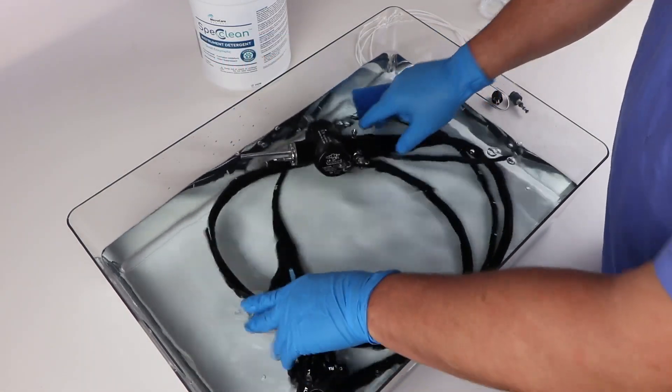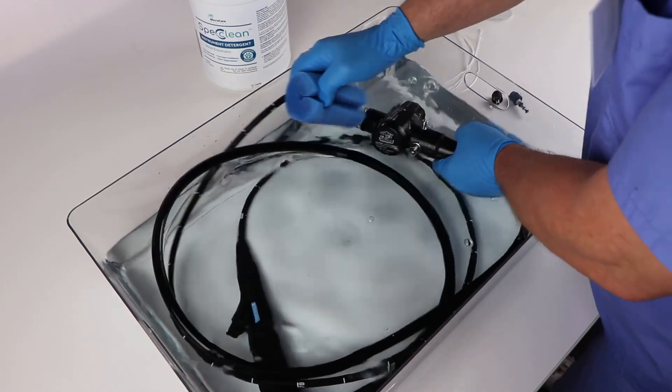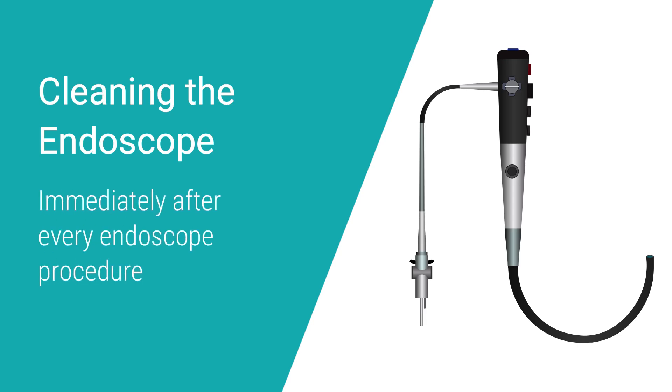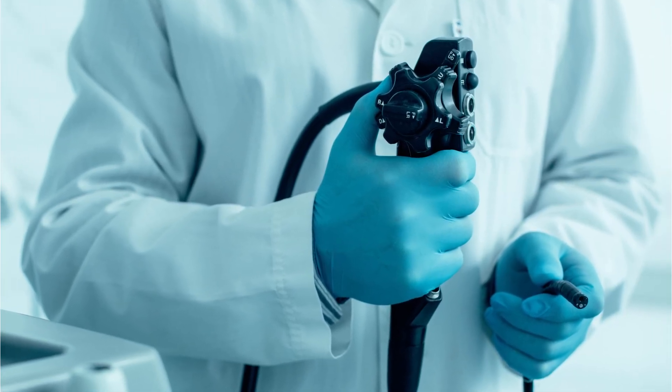Note the leak location, then depressurize the scope. Clean the outside of the endoscope and send it to the manufacturer for disassembly and repair. After a procedure, immediately clean the endoscope of gastric juices, mucus, bile, and other debris. This helps prevent dried-on soils, biofilm buildup, and potential future patient infections.